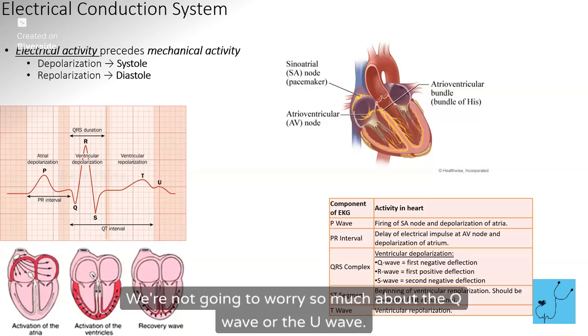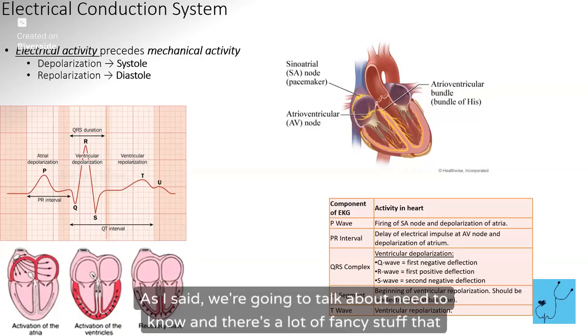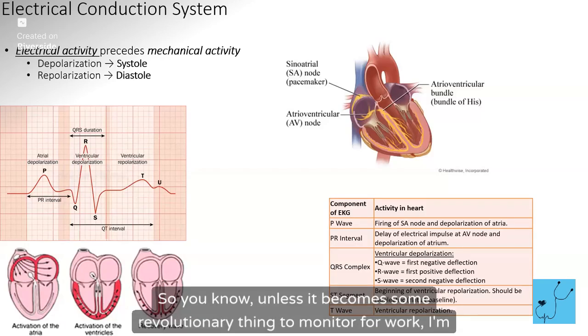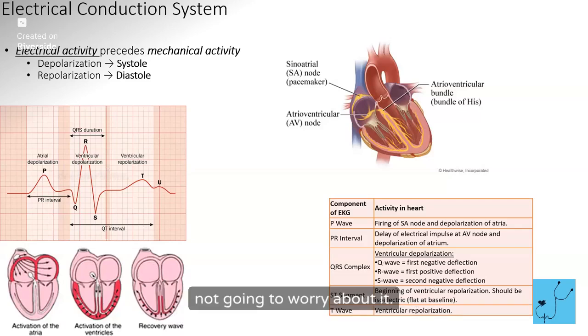We're not going to worry so much about the Q wave or the U wave. As I said, we're going to talk about need to know. And there's a lot of fancy stuff that even I don't know, but I haven't needed it in 25 years. So, unless it becomes some revolutionary thing to monitor for, I'm not going to worry about it.